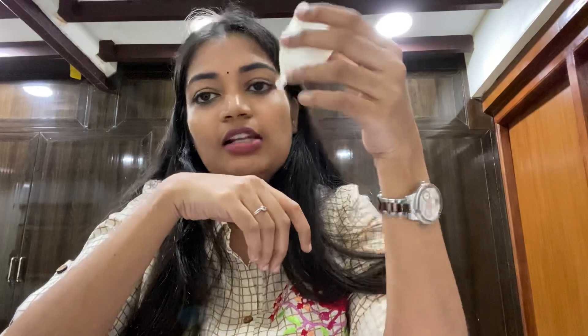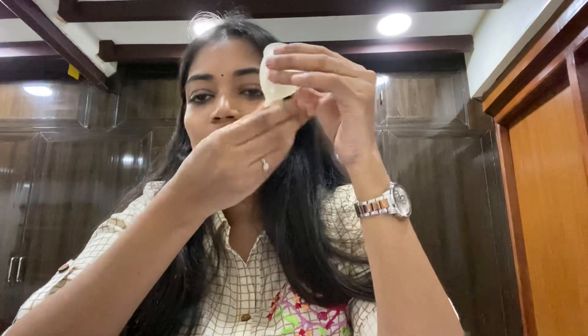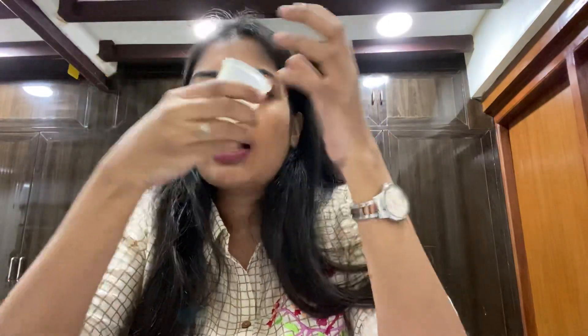Before use, you must sterilize the cup — boil it in water for 10 to 15 minutes. Then wash your hands thoroughly. When you are ready to insert, stay calm and relaxed, because tension causes tightness which makes insertion harder.